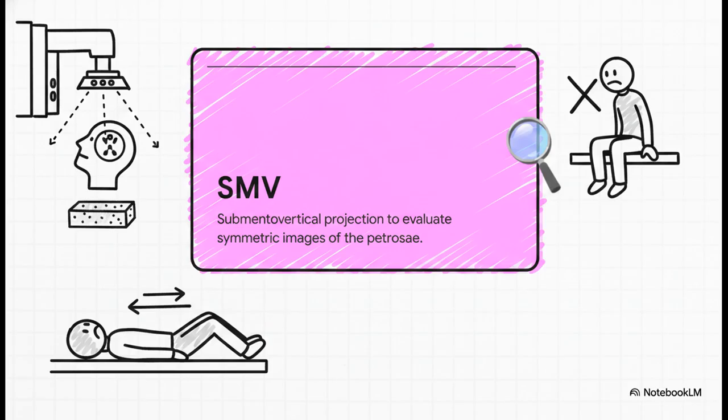When they're supine, the patient's head needs to be hanging off a radiolucent sponge to get that mid-sagittal plane perpendicular to the IR. You'll also want their shoulders in the exact same horizontal plane. And here is a fantastic comfort technique for you. Keep their knees flexed. Flexing the knees actually helps to relax the abdomen, which is crucial because this position requires some serious flexibility. We're doing radiology here, but honestly, it might feel a little bit like yoga for the patient.